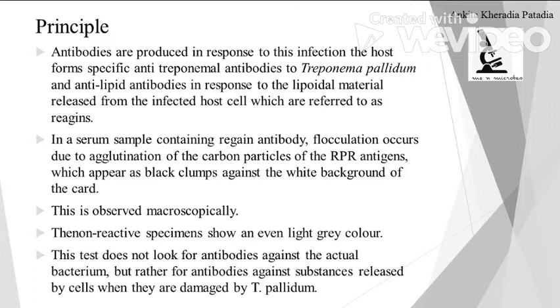The non-reactive specimens show an even light gray color. So reactive will show a dark gray color with floccules observed, and non-reactive will show a light gray color. The test does not look for antibody against the actual bacterium. The material generated in response to the infection will be detected.